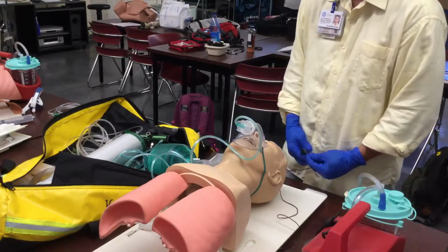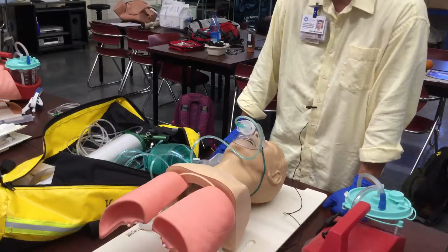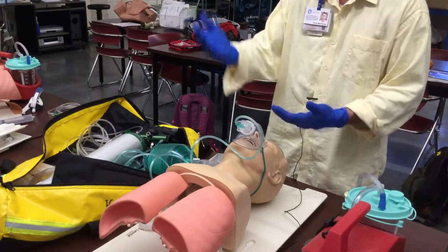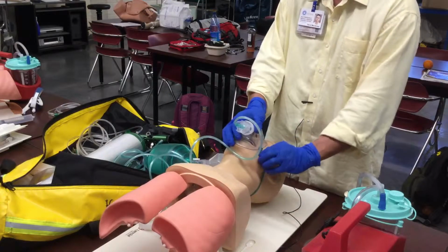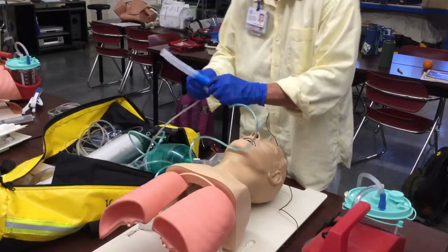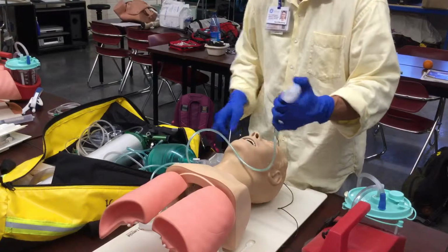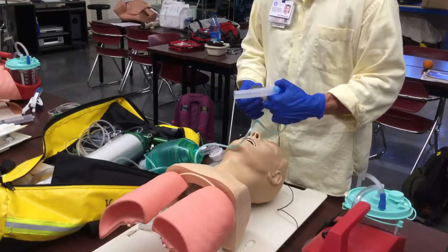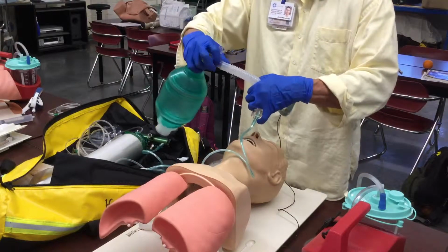Your patient still appears agitated and still has a SpO2 reading of 93%. So the person does not seem to be tolerating the oxygen in a passive flow. Pulse oximeter is low. We're going to have to now assist the breathing, so we'll take the mask off. We can then continue by using something like this device, where we would attach this to our face mask and this end to the bag valve mask.